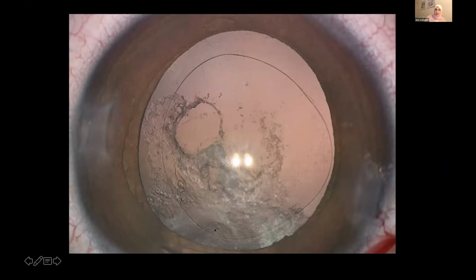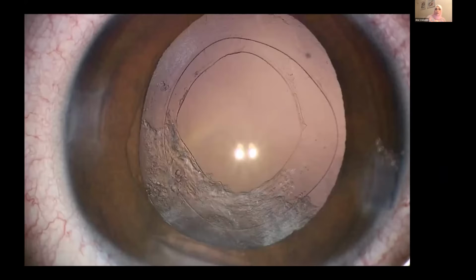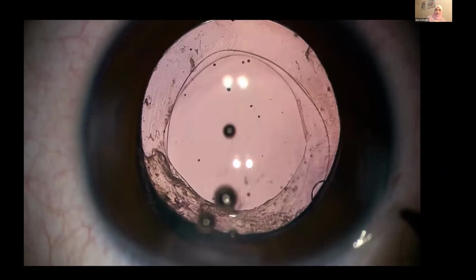How to deal? We make posterior capsular rexis, and since it is paracentral, we include the defect in the posterior rexis, and still we can implant the IOL inside the bag between the anterior and posterior rexis.